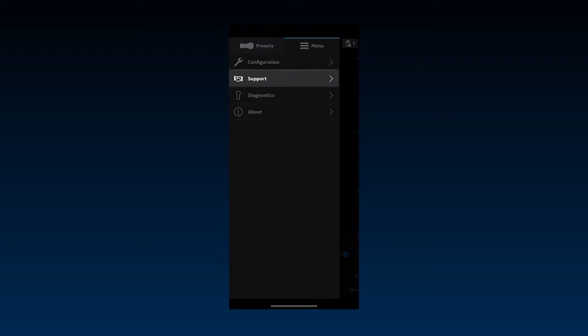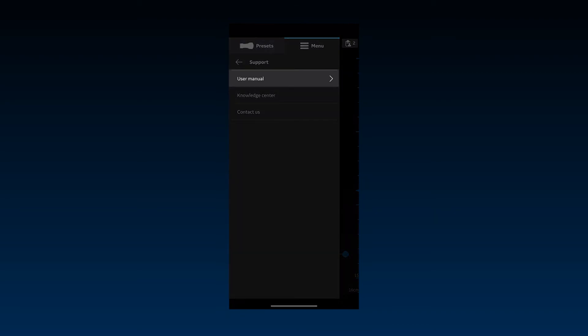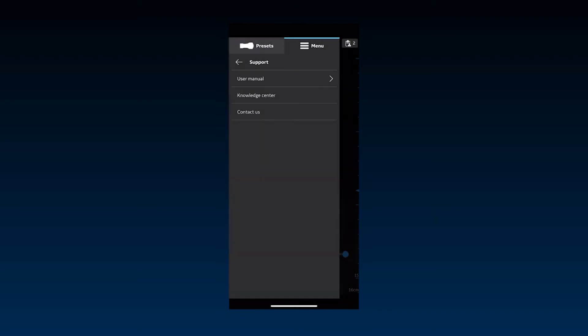The section after configuration provides various support tools. User Manual allows you to download and access the vScan Air User Manual in your preferred language.